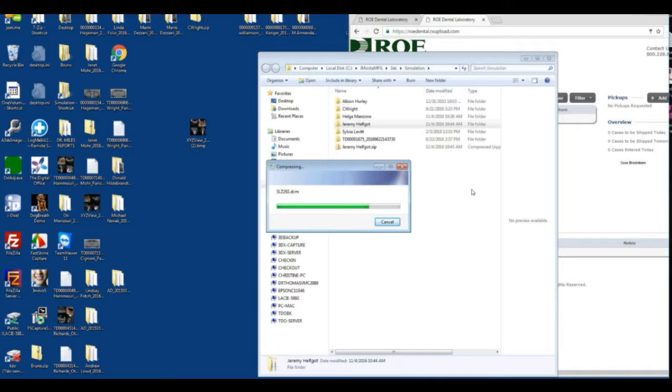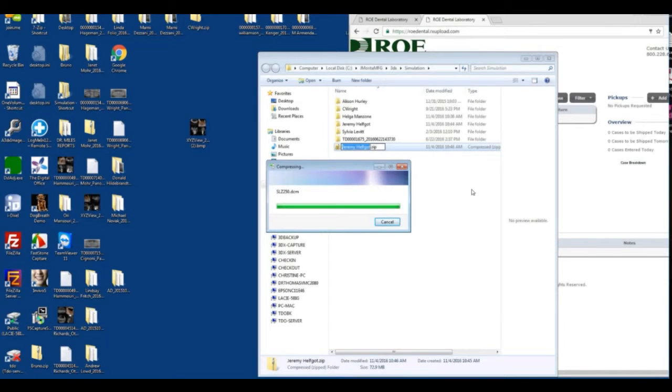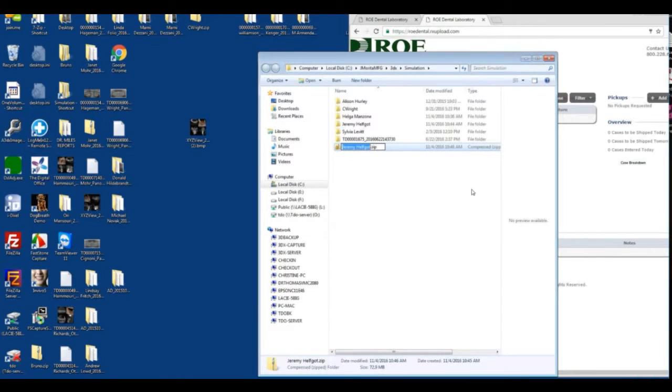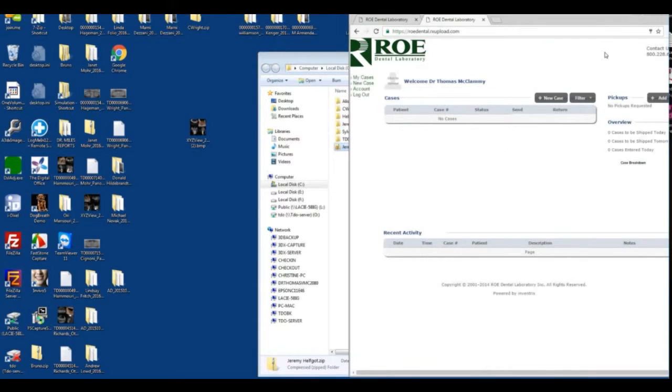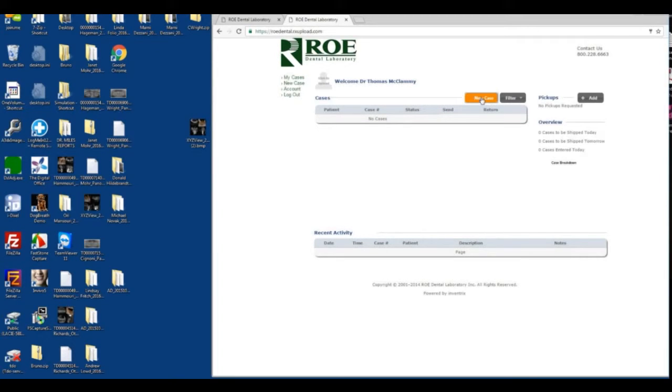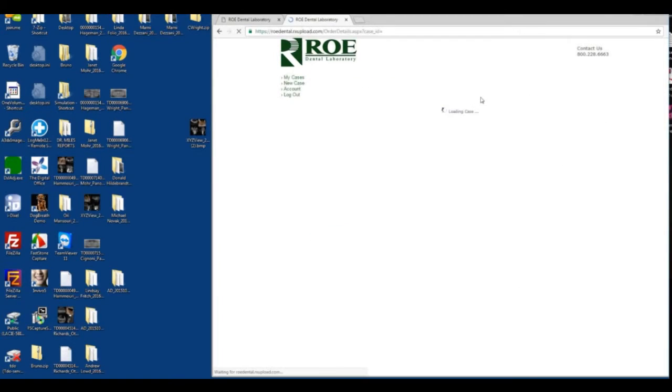Now it's zipped. Then what we'll do is go to our website, to your account, and we'll click new case.